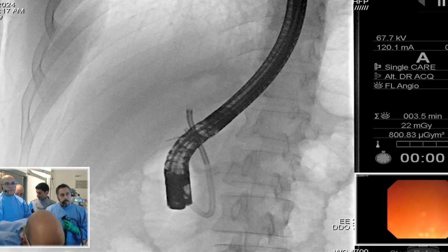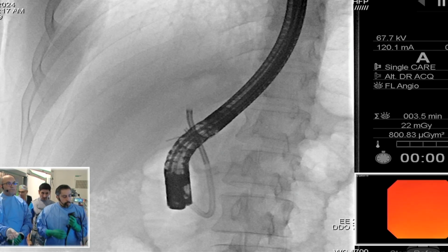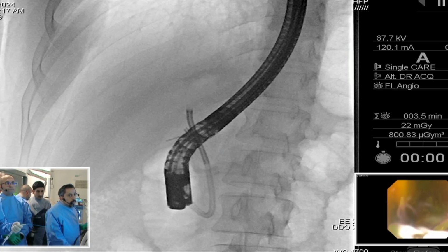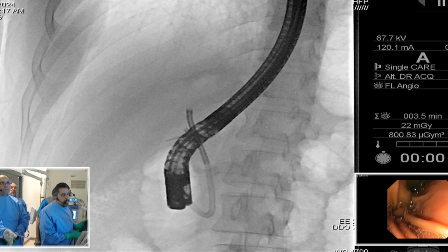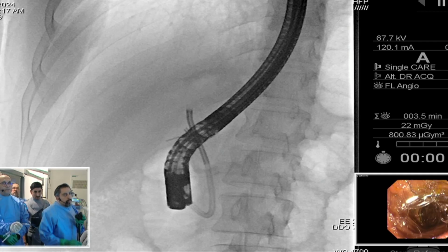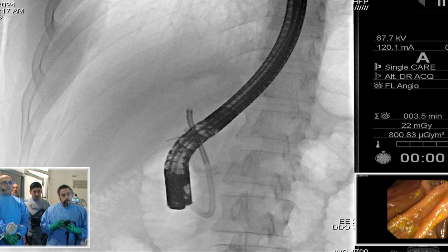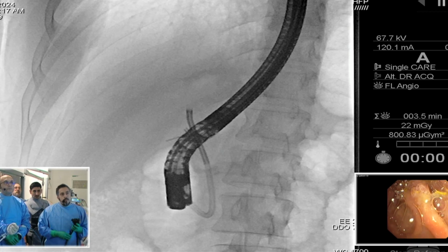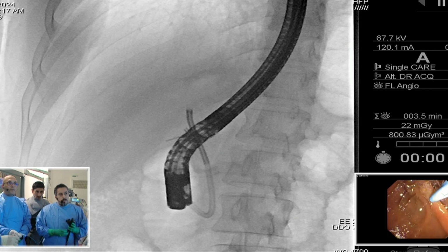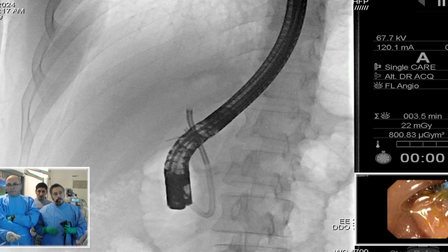Yeah, I agree. Even before, some patients just have multiple stones, and even without the use of spyglass, whenever there are multiple stones, sometimes there are still small missed stones because cholangiogram is not 100% sensitive. So I just put a stent for at least another session, to make sure the stones are dissolved if there is any remnant, or just go down through the duct, and then clean for another session. So I agree definitely for the stent. And the stents usually will improve the bile flow, which makes any remnant stones softer with time and easier to extract.